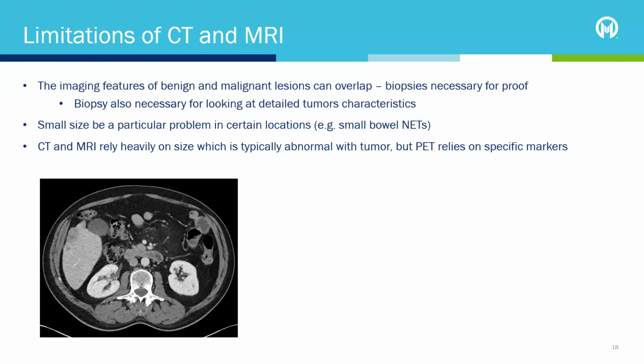That's why, like we said, the imaging goes to the doctor, and the doctor puts together the whole picture of what's going on. And it's up to that physician then to say, well, even though this is not 100% on the imaging, it's almost 100% based on the clinical circumstances. So we're going to go without a biopsy, or we need a biopsy.